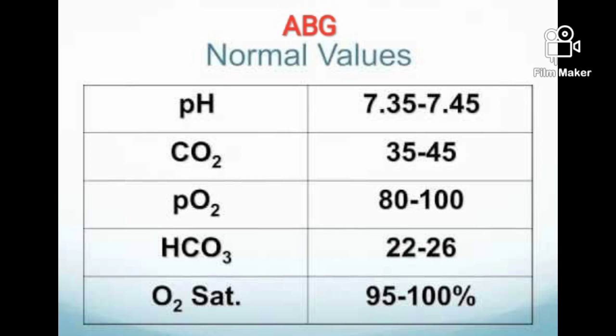Respiratory alkalosis with metabolic acidosis, the pH is in the normal range and there is a decrease in the carbon dioxide tension and a decrease in the bicarb as well. This happens in sepsis, salicylate toxicity, renal failure with congestive heart failure, pneumonia, and advanced liver disease.